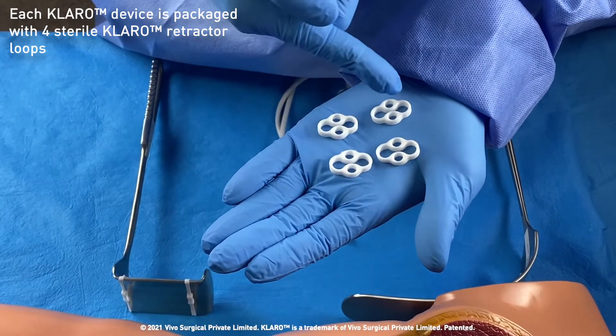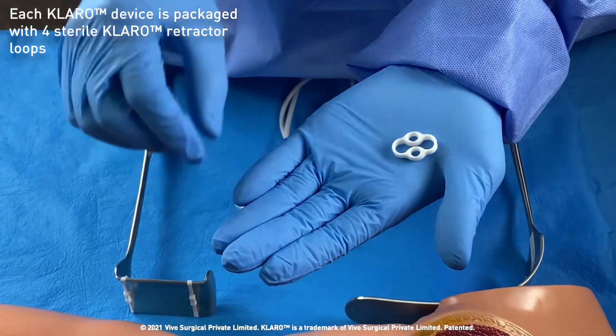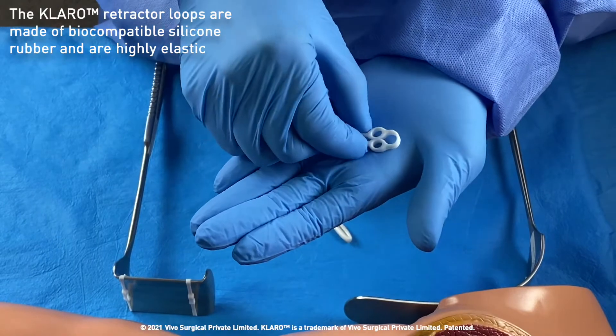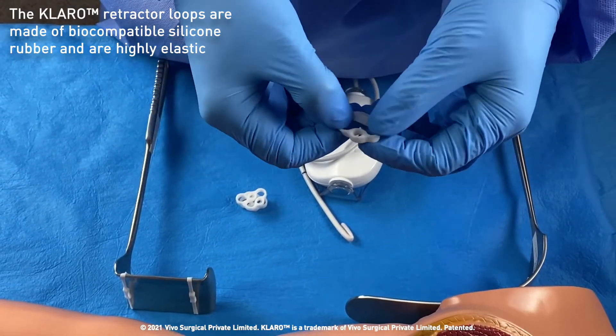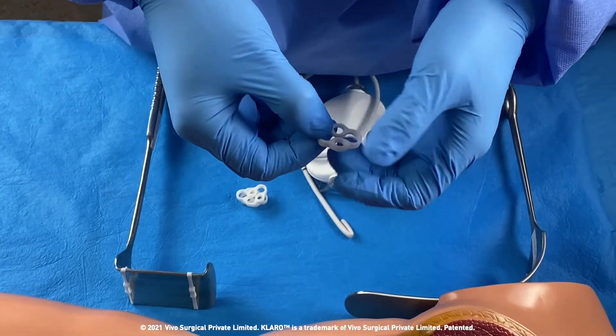Claro comes with four retractor loops to enable attachment onto large rigid retractors. A retractor loop consists of one larger central loop and two smaller side loops. It is made out of biocompatible silicone rubber and is highly elastic.